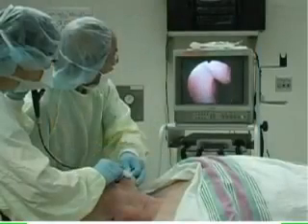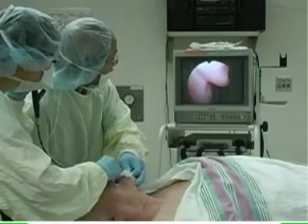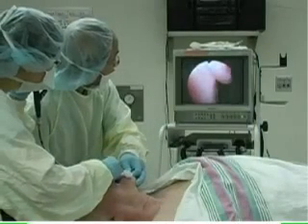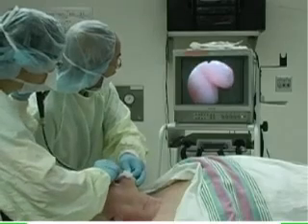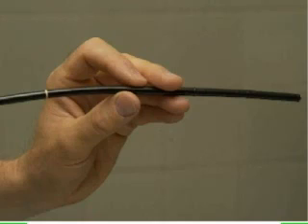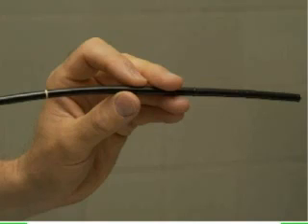When a video camera is coupled to a fiber optic bronchoscope, the divot must be adjusted to the 12 o'clock position to maintain correct orientation. The practitioner's non-dominant hand holds the shaft of the bronchoscope between the thumb and the index finger, a few centimeters proximal to the tip.